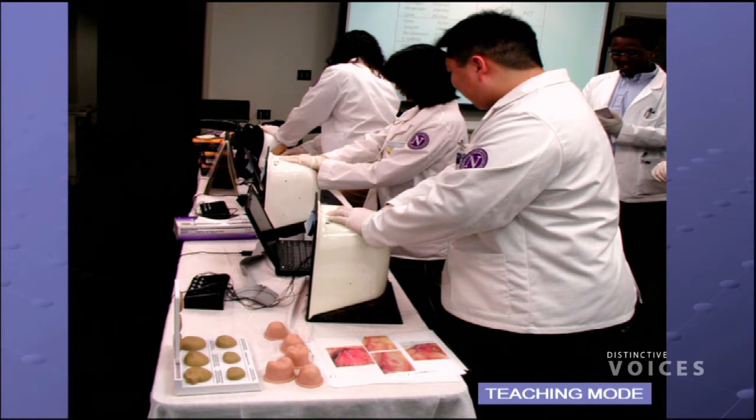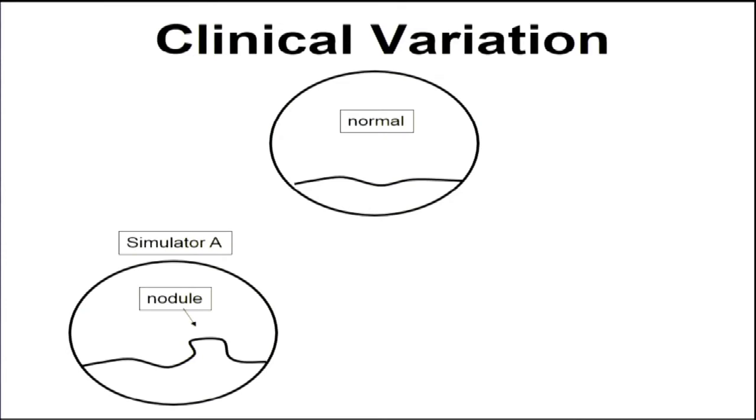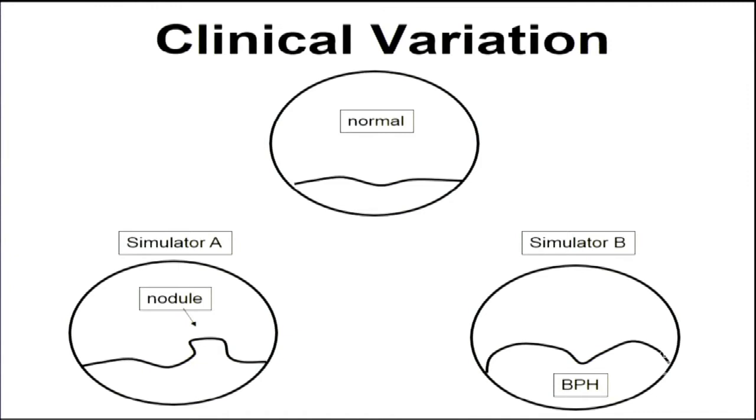All the models look the same, but there's different organs on the inside. And they're all looking to the side at the computer to see where they're touching and with how much pressure. For the experiment that I did, if this is sort of the normal, it's hard to explain, but if this is what a normal rectum and prostate looks like through an anoscope, the first model that I presented was one that had a fairly large, hard, abnormal lesion on the right lobe of the prostate. The other one had bilateral enlargement, which is supposed to represent benign prostatic hypertrophy. And then they also had a soft rectal mass, exactly opposite the prostate.